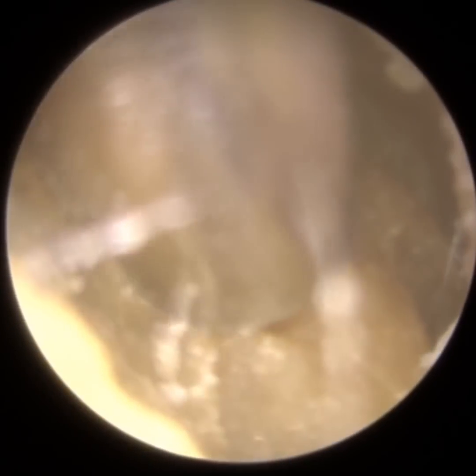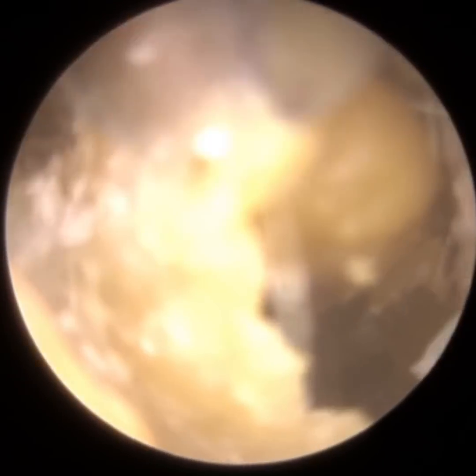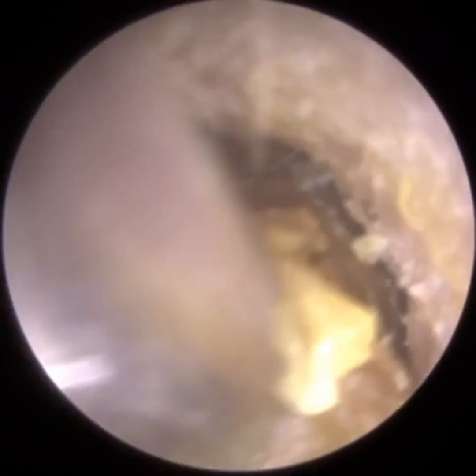I actually did the procedure in the left ear first when the patient attended, but for the purposes of the video, I'm showing you the right ear first. You can see in this right ear there's a lot of debris here, a lot of dry skin. This is not really earwax, this is all dead skin that we're removing.